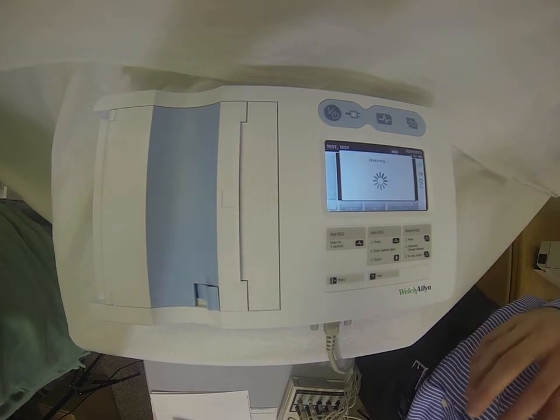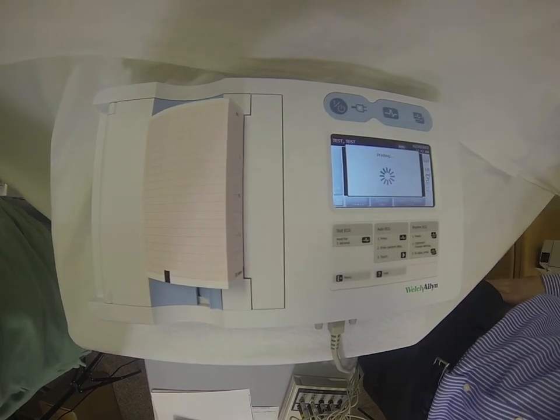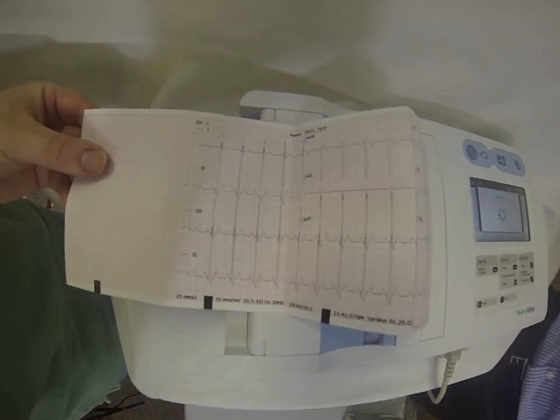Once that information is entered, we just hit the Next button and it's going to print us out our ECG summary report. The summary report will show a printout of all 12 leads as well as a rhythm strip.